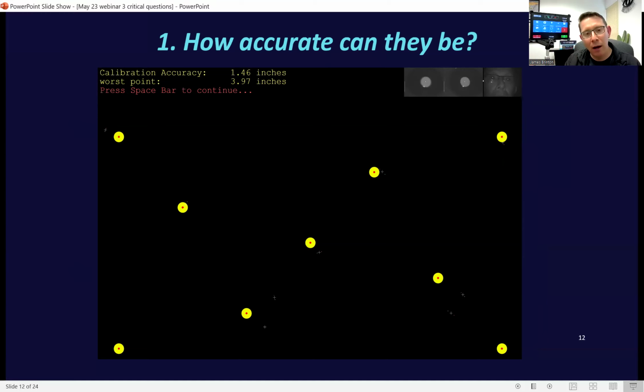What it does is the Eyegaze Edge calibration program will automatically recalibrate the weak points until it gets past the mathematical threshold where we think they're going to go in and have a pretty good experience. So it does a lot of the work for us if we've set the eye tracker in front of the eyes appropriately.